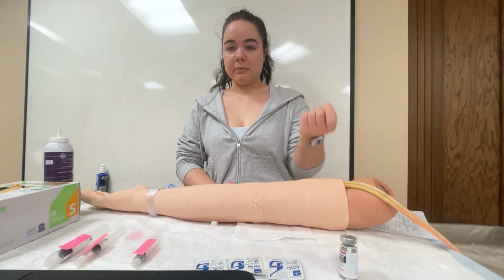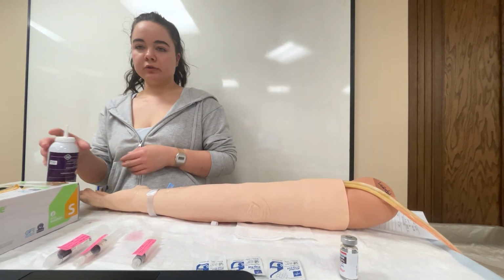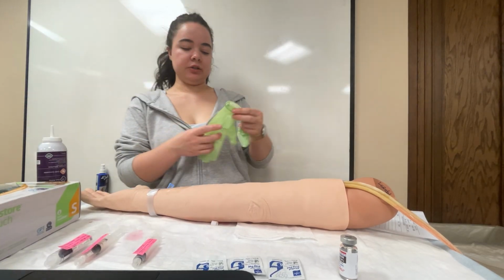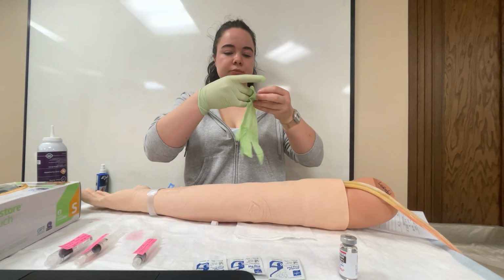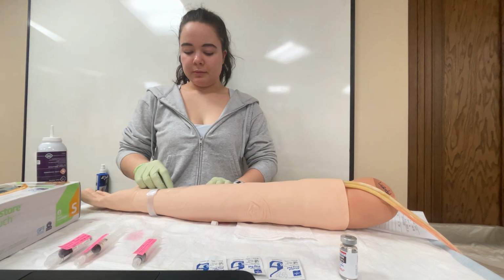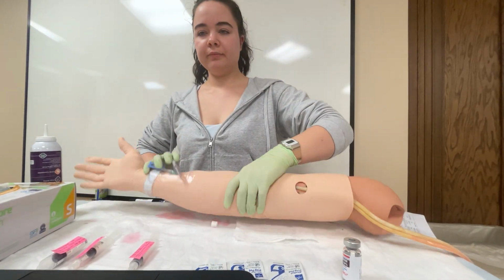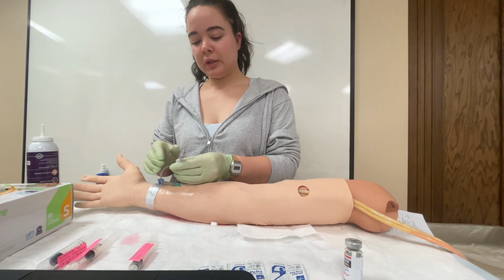Like I said, I've scanned my medication. I'm going to go ahead and assess the IV. I'm looking for infiltration and inflammation. None are noted. Mr. Ferdinand, this should only take us about 5 minutes or so. I'm going to go ahead and unlock my J-loop, or unclamp it, if you will.